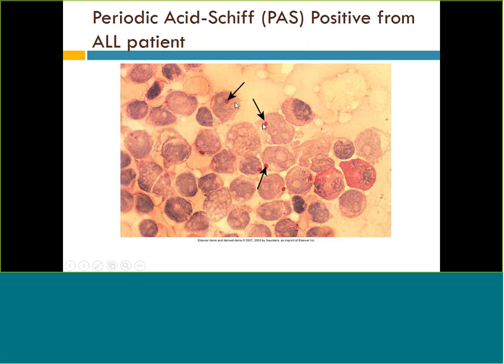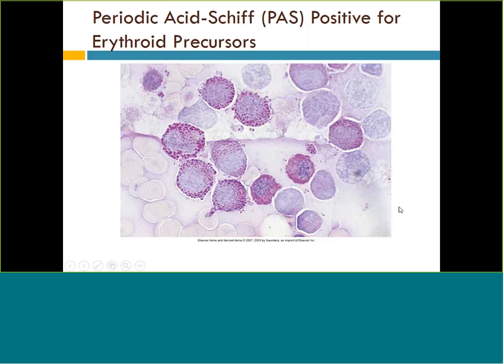And so in this picture, it's showing those glycogen stains that have reacted, showing positive. And then there it is in the erythroleukemia, so in the erythroblast.